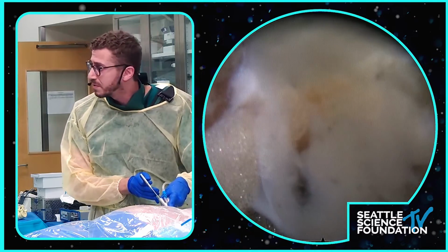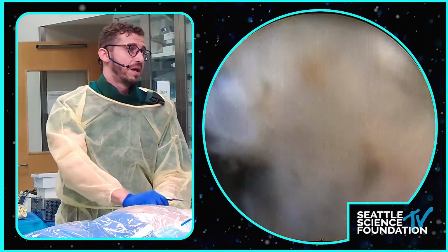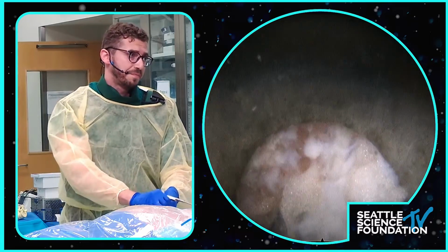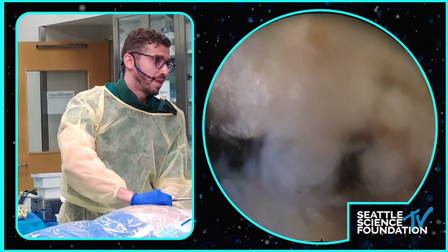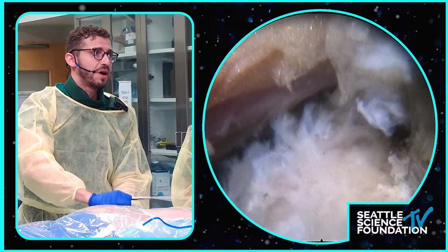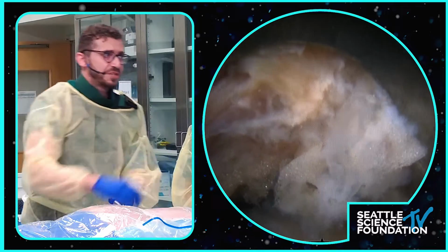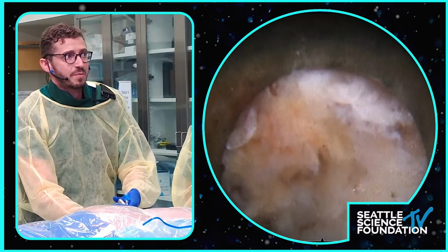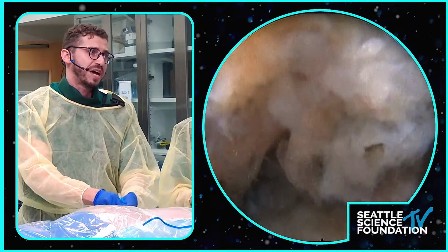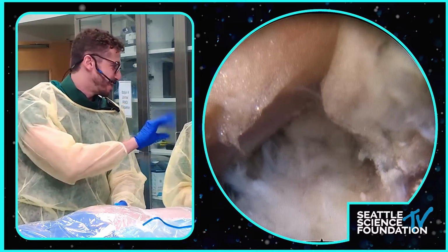But any other? So I think you brought up a great point. The yellow ligament actually goes to the mid to tip of the transverse processes, so the yellow ligament also helps you to identify the exiting nerve root. So you just follow, like you're doing right now. I'm just following the L4 nerve root here all the way up to where it takes off. And usually with the endoscope, because you're coming in from such a crazy angle, the L3 root is going to be somewhere up here. It's going to look like it's in a different plane because you're coming in so diagonally. But as long as you follow that nerve root all the way up, then usually it's fine. Can I have the pituitary, please?